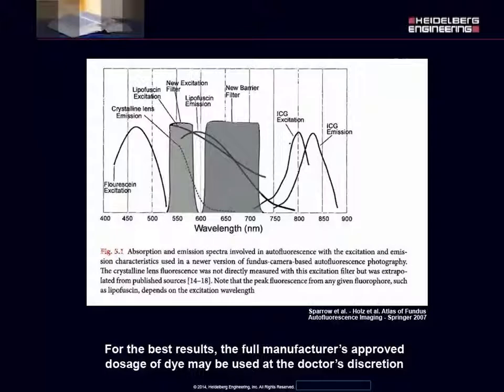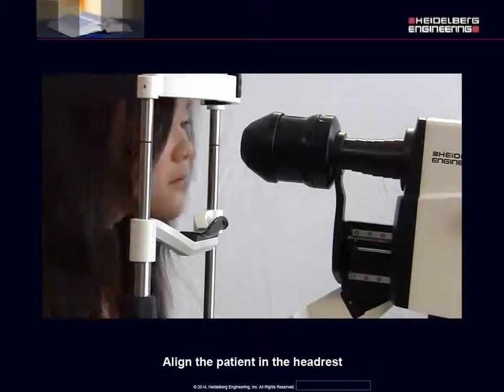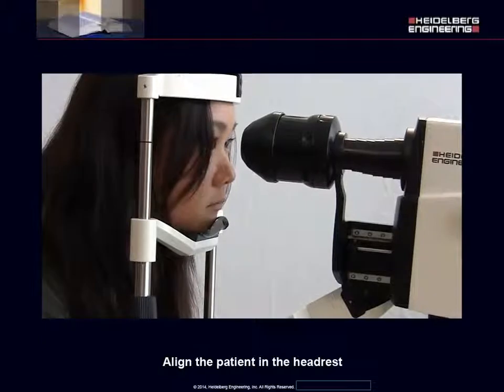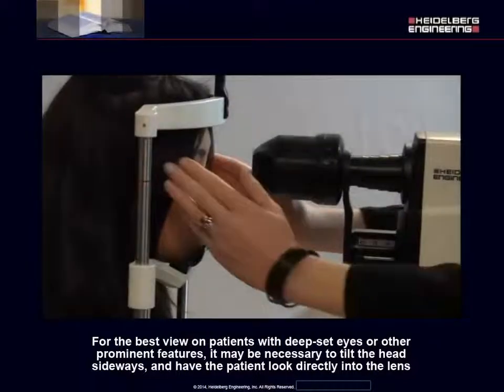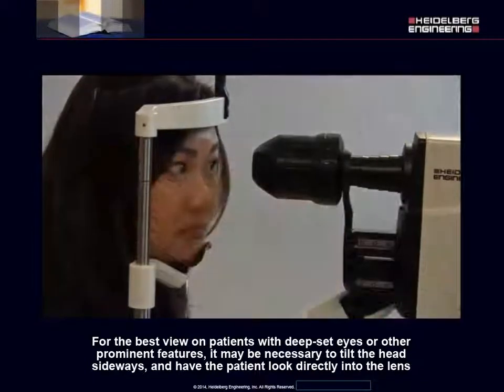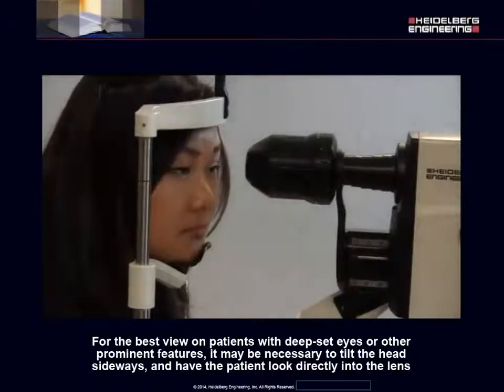For the best results, the full manufacturer's approved dosage of the dye may be used at the doctor's discretion. Align the patient in the headrest. For the best view on patients with deep-set eyes or other prominent features, it may be necessary to tilt the head sideways and have the patient look directly into the lens.